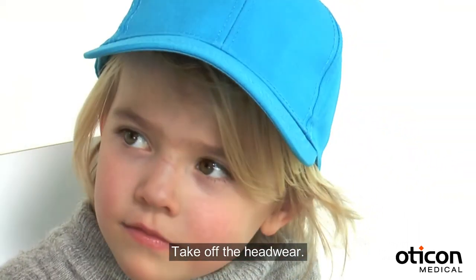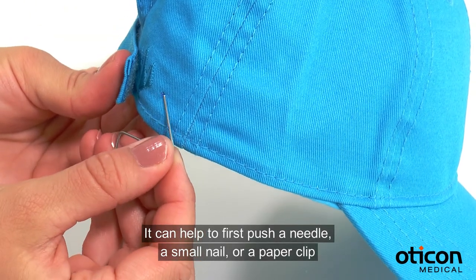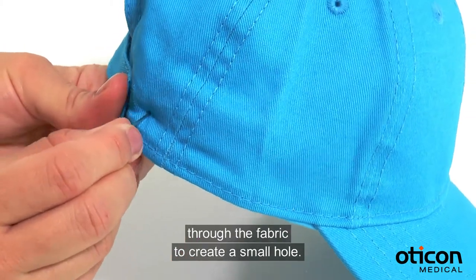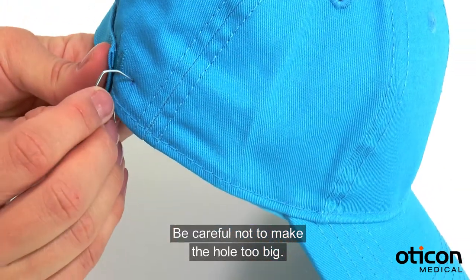Take off the headwear. It can help to first push a needle, a small nail or a paper clip through the fabric to create a small hole. Be careful not to make the hole too big.